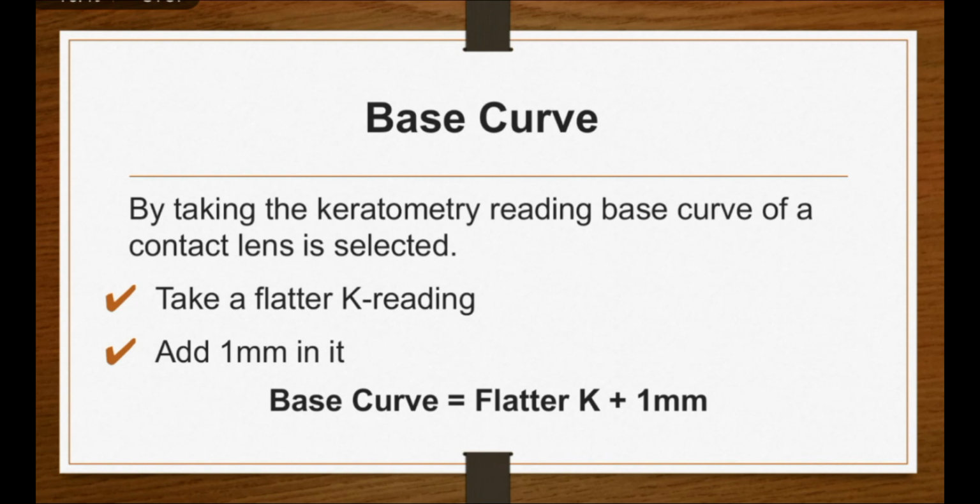7.8 millimeter is the average or normal value of the radius of curvature. Less than 7.8 millimeter shows that the cornea is steeper, meaning the patient is turning toward myopia. Greater than 7.8 millimeter states that the patient's cornea is flatter. So the values that are larger will be the flatter ones, in millimeters, right? I am talking about millimeters.